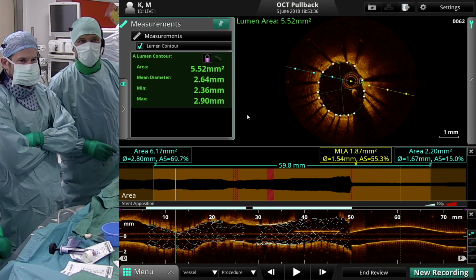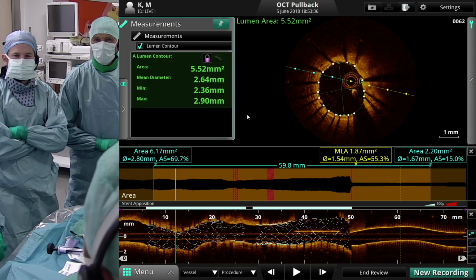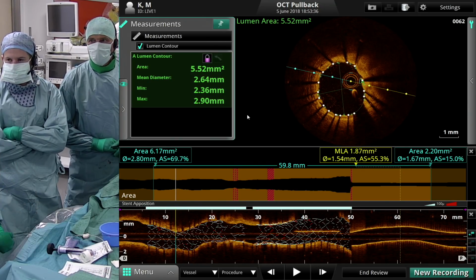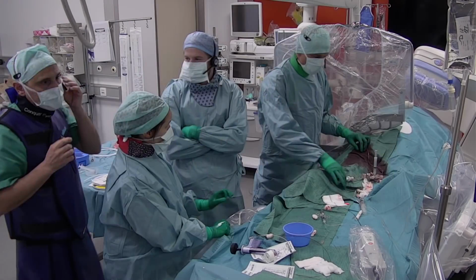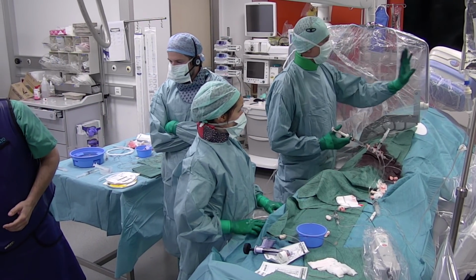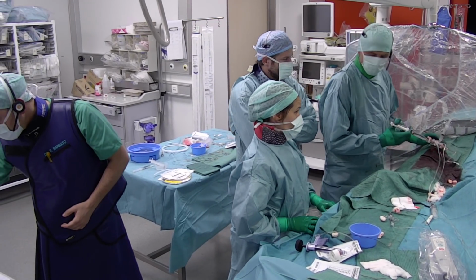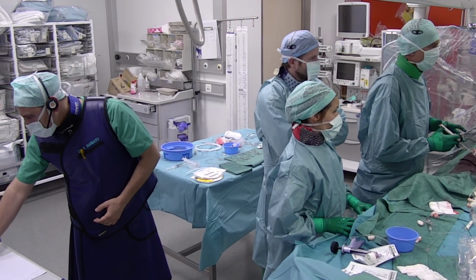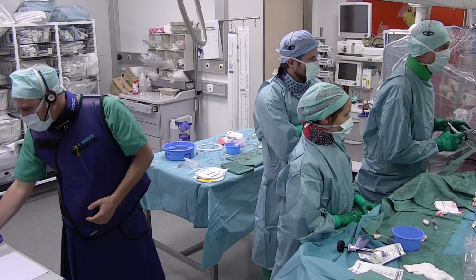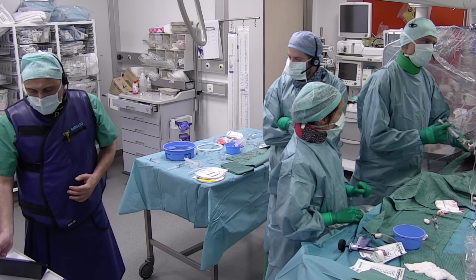Okay, so I think that we are going to close the case if you agree. Yeah, actually, we could close the case from the cath lab and still have the time to address some of the questions we have. I just take the opportunity that you are here. So let's go quickly to the first question, Gabor, since you are now free.